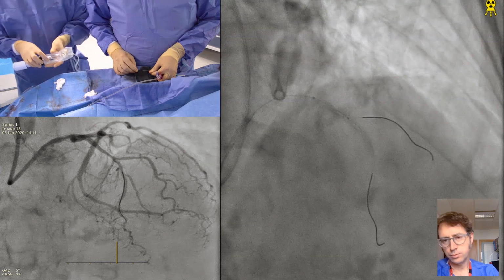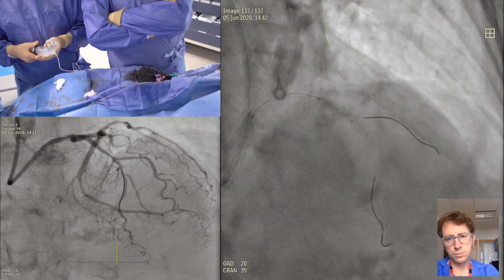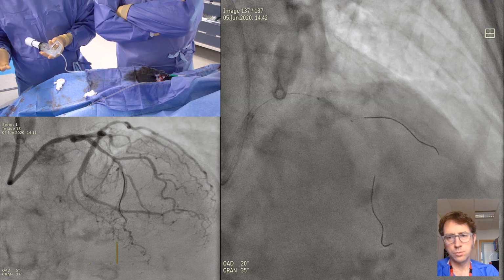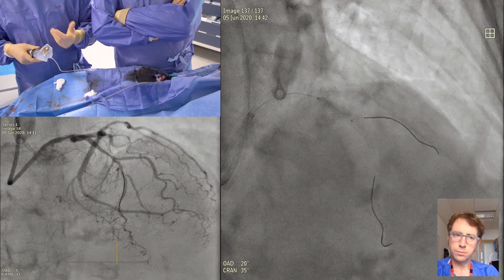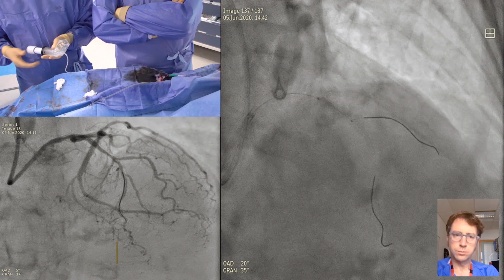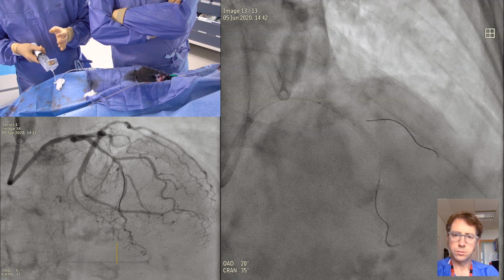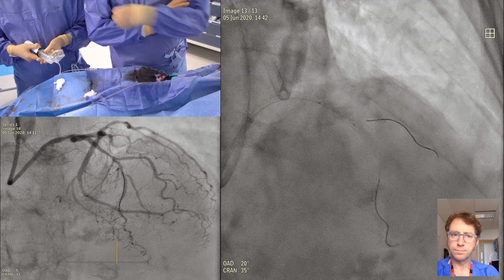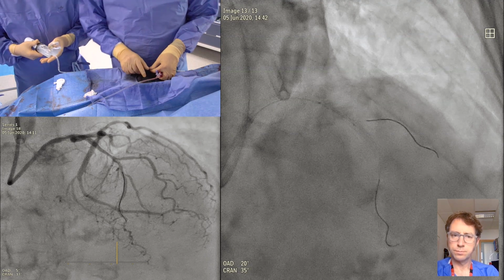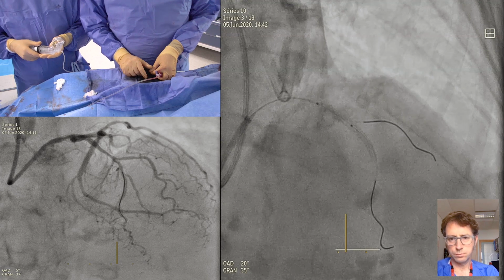Yeah, Tom, I think it's a very important point. So of course, we select the stent according to the distal reference, but also to the expansion capability of the stent, which is also very important. In this case, the 2.25 design of the stent is the same as the 3.0. So it's in fact a 3.0 stent. So I think it's not an issue. Just we check your position. Yeah, of course, we pay attention to the position of the balloon.